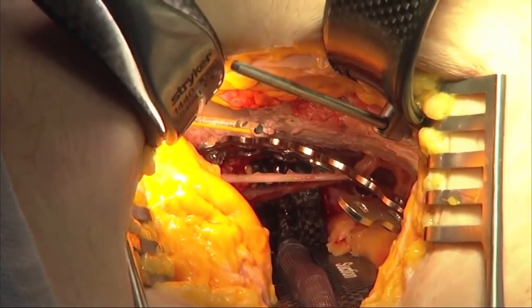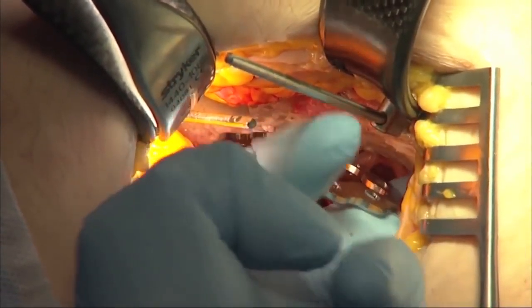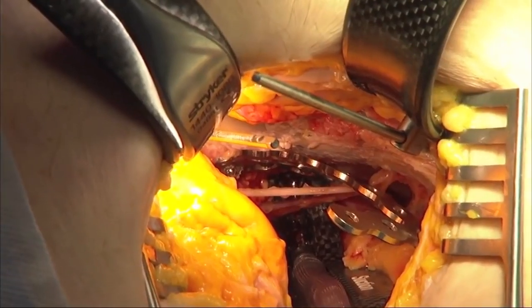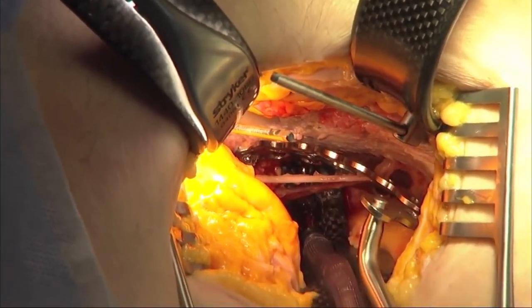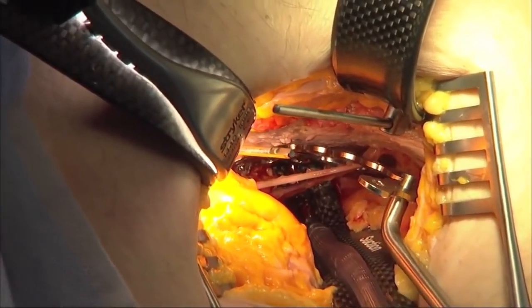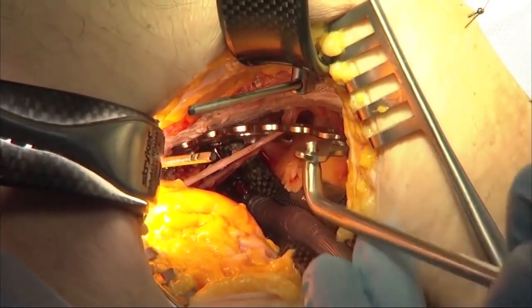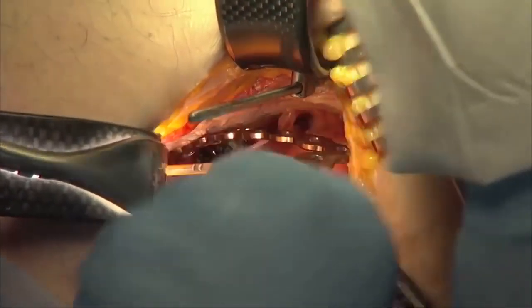Final thing that we should show you here is the in situ bending iron. And you can see how this plate is laying off the bone and also has this more superior flange that we like to bend over the superior ramus in the pubic body. And this bending iron allows us to do that with the plate in situ so that we get a more custom bend to the plate once it's already in and it contours to the actual surface and anatomy of the pelvis rather than having to do it outside of the patient and getting this bend wrong.